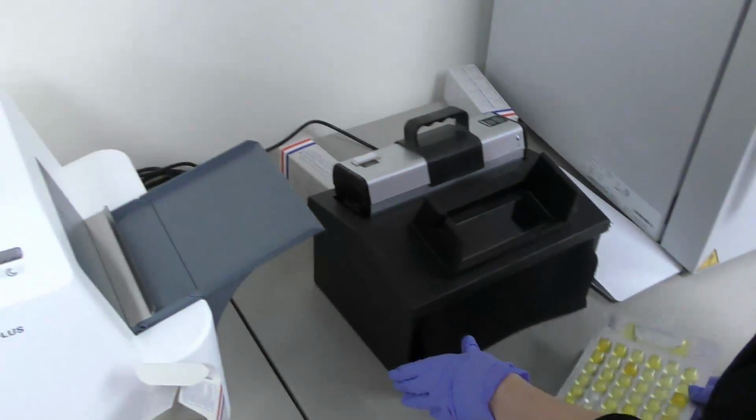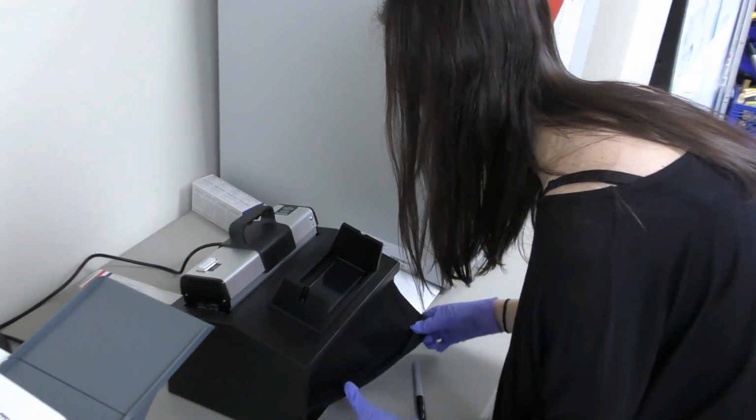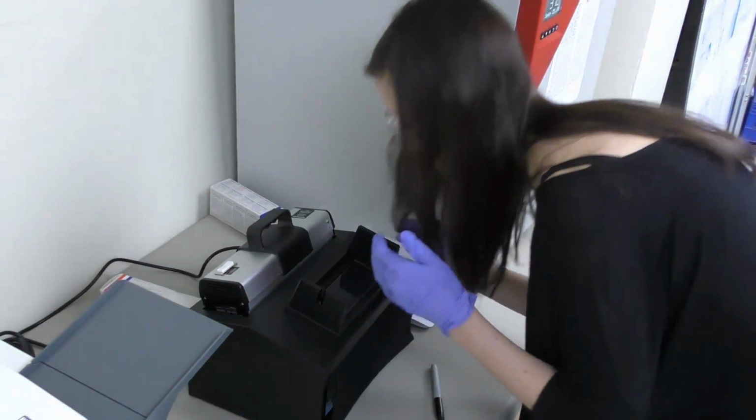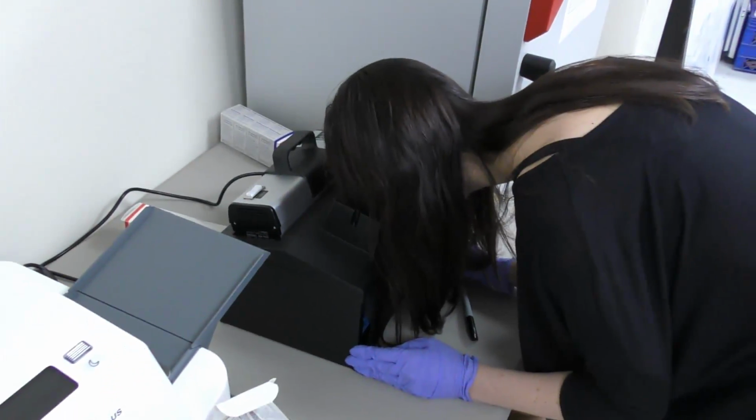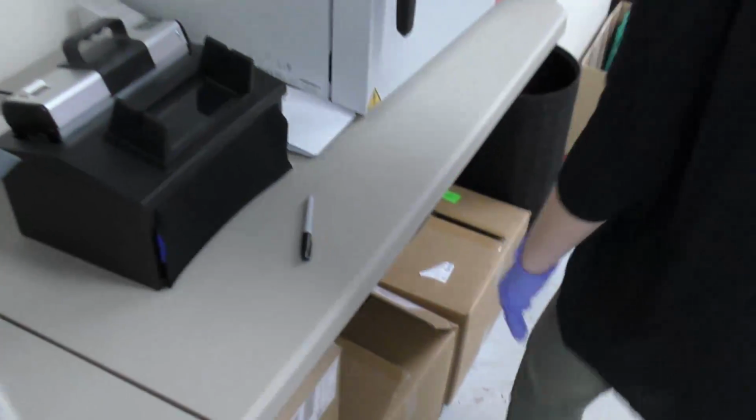What you would do is turn on your UV light source, and then place your tray in the light box here, and I'm not surprised by the result I'm seeing. You look through, and then you start counting the number of positive wells. We can have you come in, and if you want to take a look, you can look in there and see how it fluoresces. It's a very strong fluorescent color.